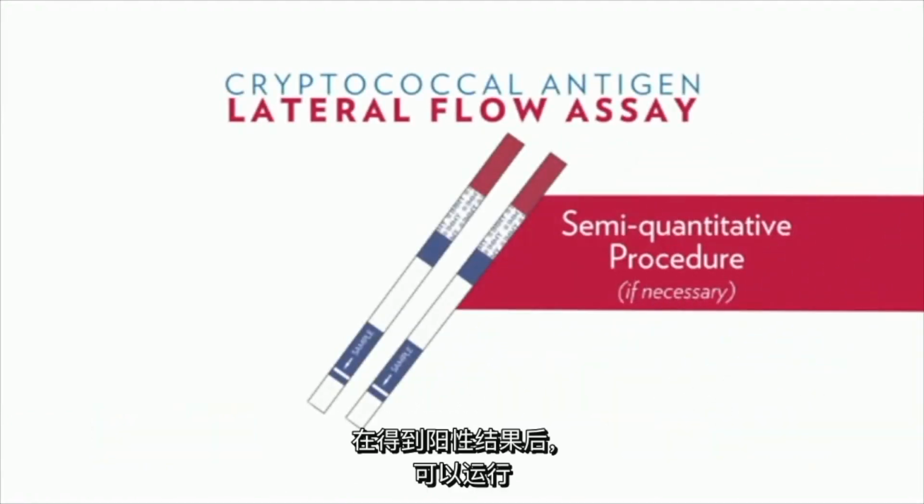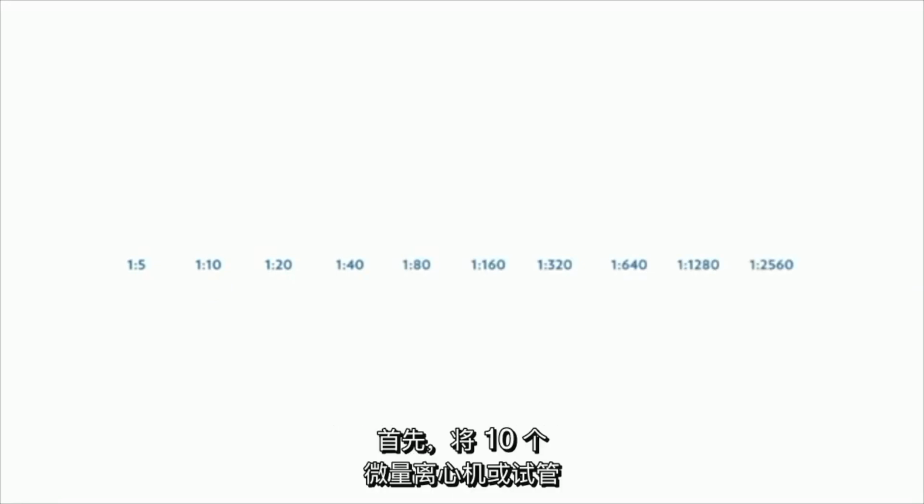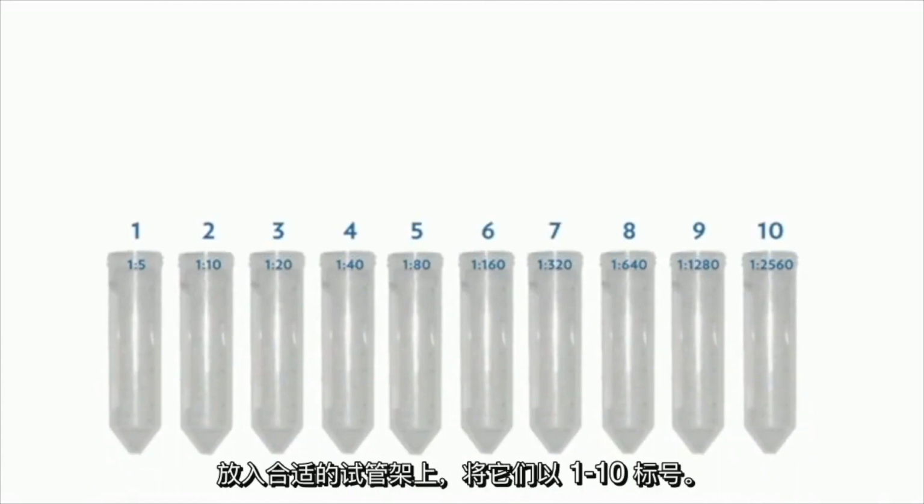Following a positive result, the semi-quantitative procedure can be run to determine the titer of the specimen. Prepare dilution starting with an initial dilution of 1 to 5 and follow with 2-fold serial dilutions up to 1 to 2560. First, place 10 microcentrifuge or test tubes in an appropriate rack and label them 1 to 10.